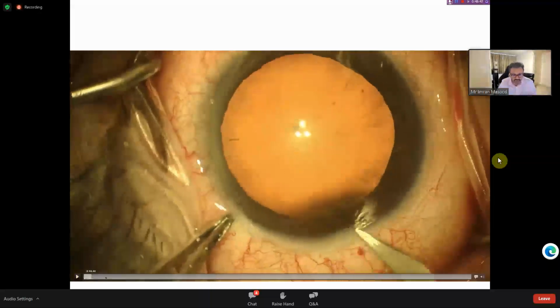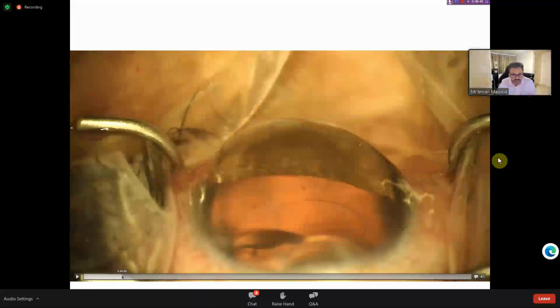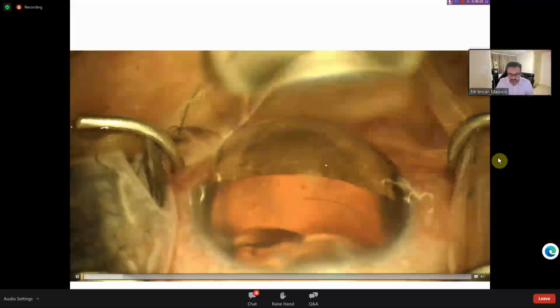I'm just going to go through the phaco. We don't want to bore you with the phaco. So there's the view we're looking at, and then we put on the gonio lens. We've put some viscoelastic on the eye to act as a coupling agent. Now I'm just going to stop here. This is a patient who's had previous angle closure, and therefore the trabecular meshwork is very, very pigmented. When you take the lens out, you get deepening of the angle. So you can go in with an iStent in these cases.